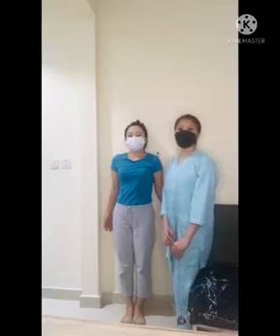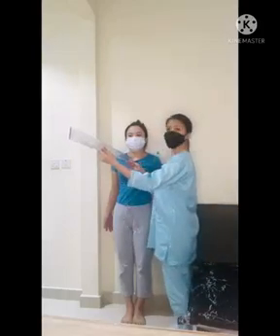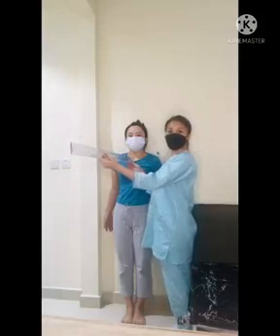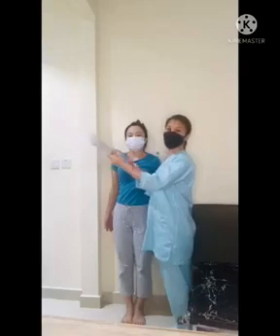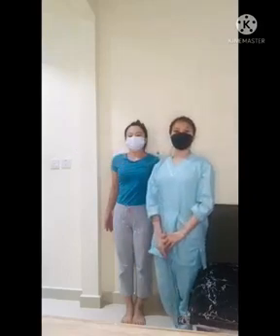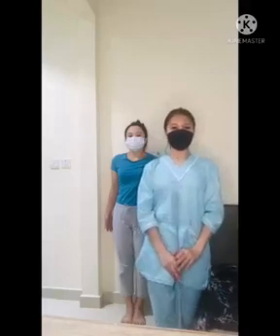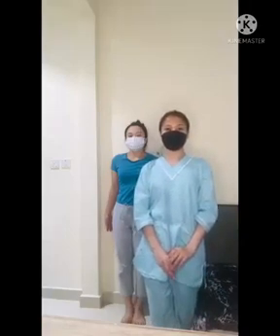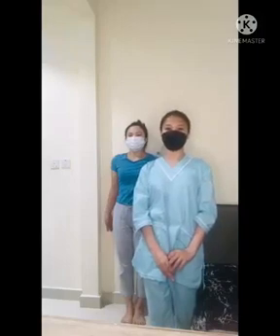So, the central ray in this projection is directed to the acromioclavicular joint. The structure shown in this projection is a bilateral image of the acromioclavicular joint, for dislocation, separation, and the relationship of the clavicle and the acromion process.